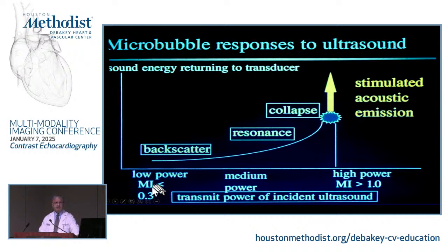Low power, or low mechanical index, is like 0.3, 0.2, even 0.1. Okay, so the range is not huge, but you need to know that because the display on your screen of the ultrasound machine will have that mechanical index.